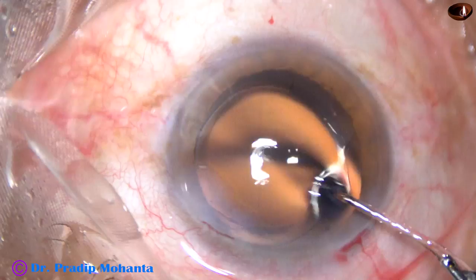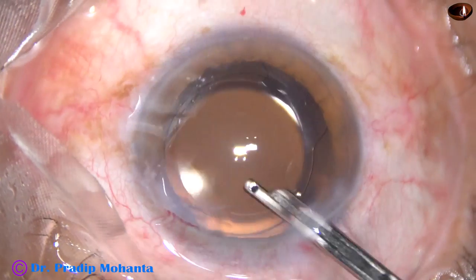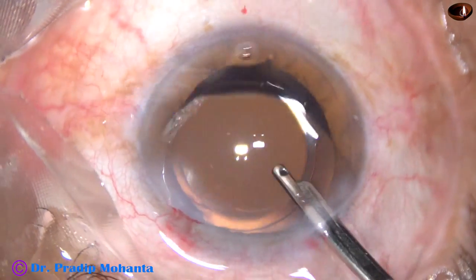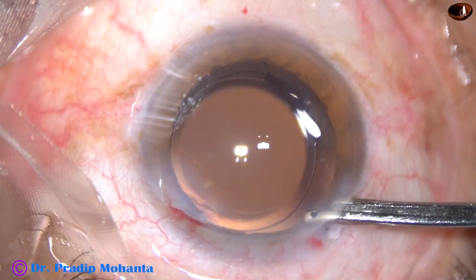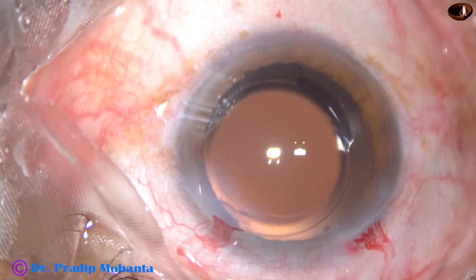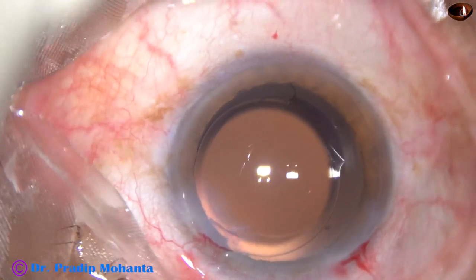And now this is the final lavage of the anterior chamber. A gentle stream of BSS is directed towards the corneal endothelium, and whatever viscoelastic sticks to the corneal endothelium comes out at this time. So we are towards the end of the surgery. This is how the anterior chamber is formed. A few drops of moxifloxacin are applied over the cornea. Integrity of the wounds are checked, and the case is concluded.